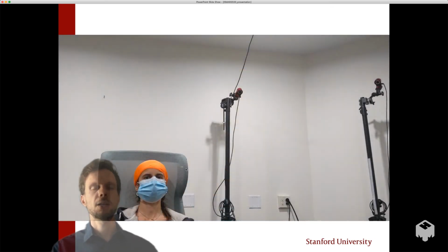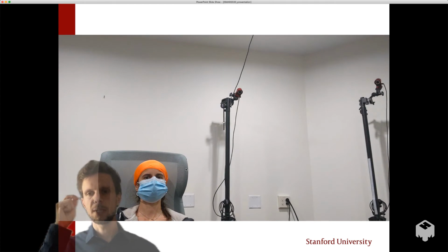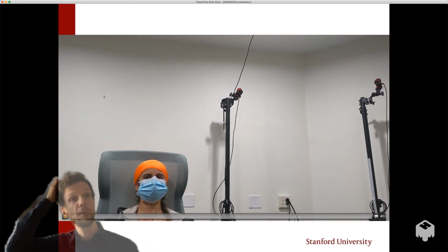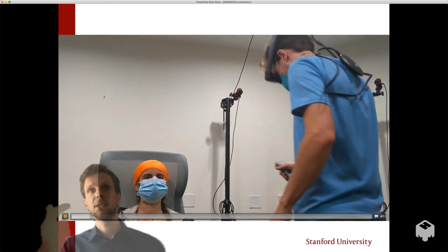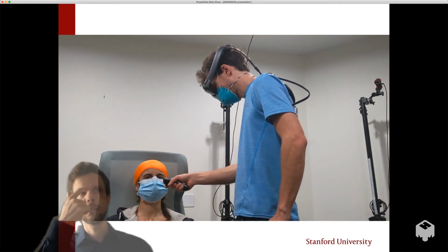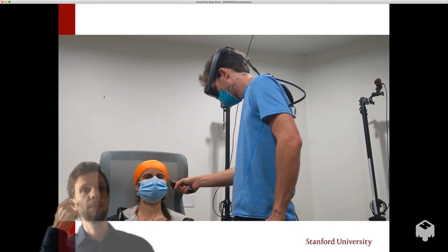Now in reality, if you don't do it through the mixed reality capture, but just place them without taking video, the procedure is actually much faster. So here we see a view from outside, where you unfortunately do not see the virtual content, but you place virtual fiducials at the nasion, nose tip, left eye, and left ear.